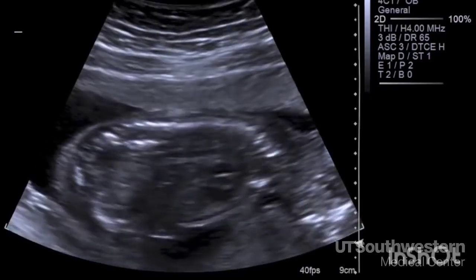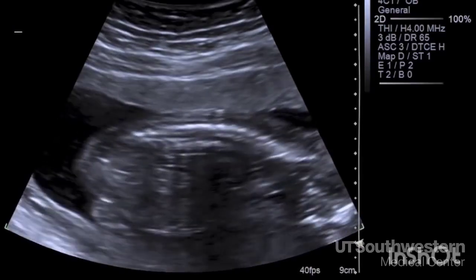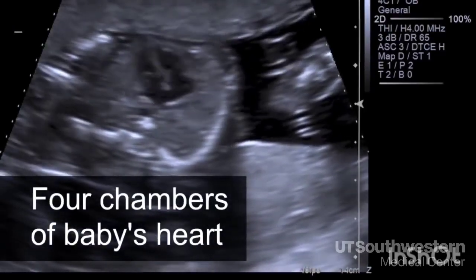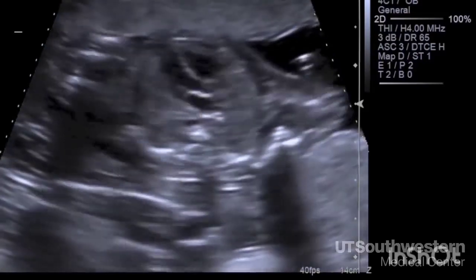With the spine up towards us, we can also see some of the big blood vessels in the baby, like the aortic arch, the black candy cane-shaped structure in the chest. The heart is one of the most important organs that we look at during an ultrasound. It appears black because blood inside the fetus is really just another kind of fluid.